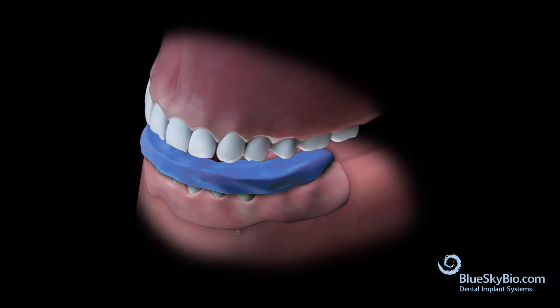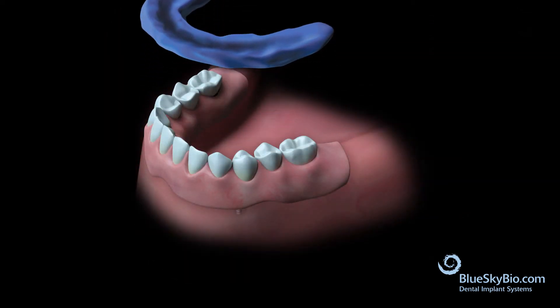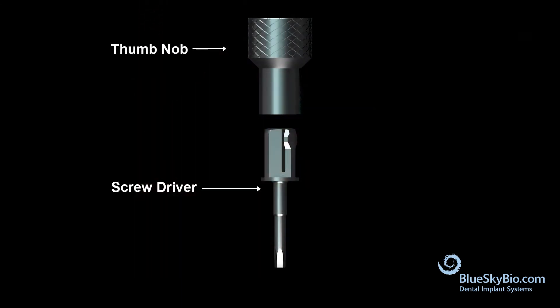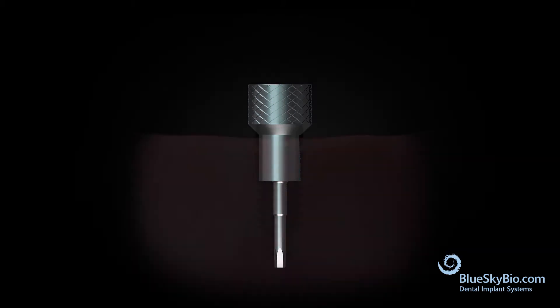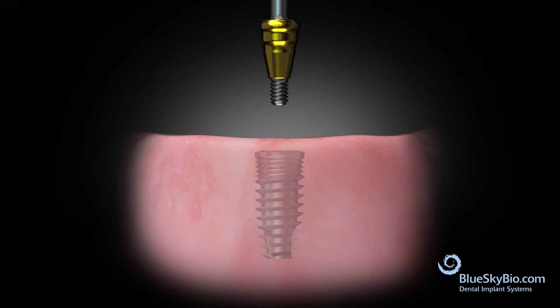Have the patient bite down. After the bite is taken, remove the impression and denture. Connect the thumb knob to the screwdriver and remove the healing abutment. Insert the abutment into the implant and tighten the abutment first with finger pressure.